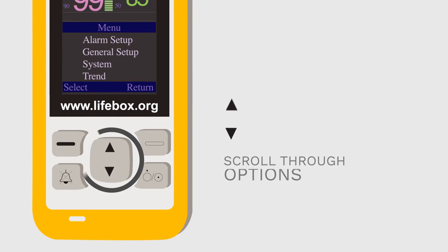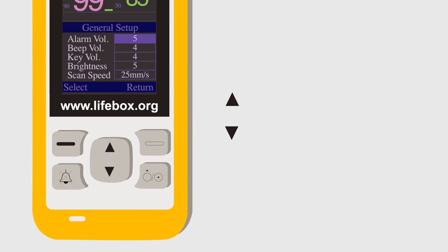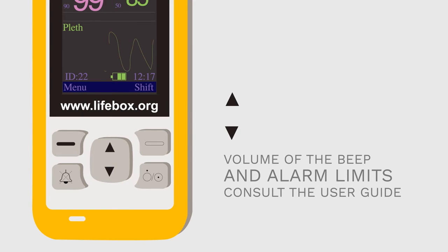The button in the middle, the up-down, allows you to scroll through options in the menu. The menu allows you to change certain features, such as the volume of the beep and the alarm limits. For more information, consult the user guide.